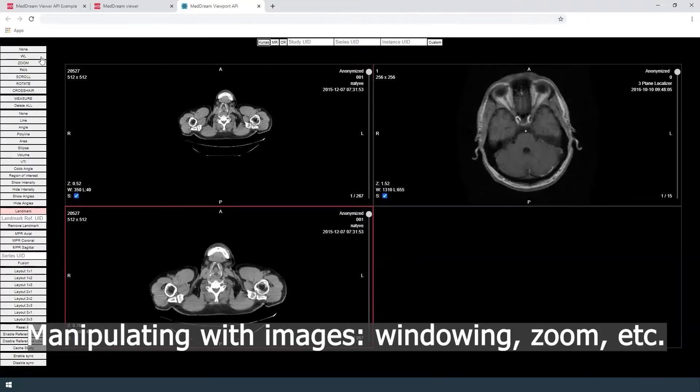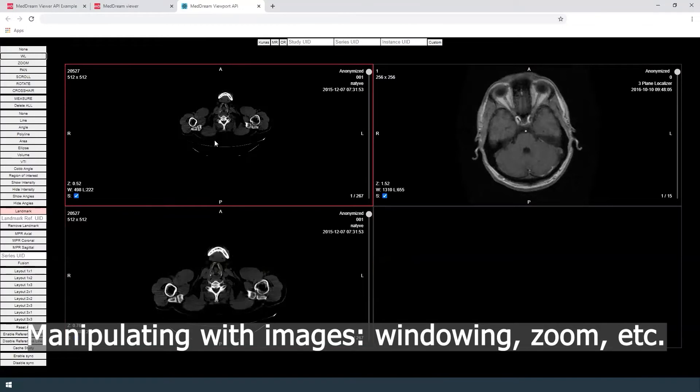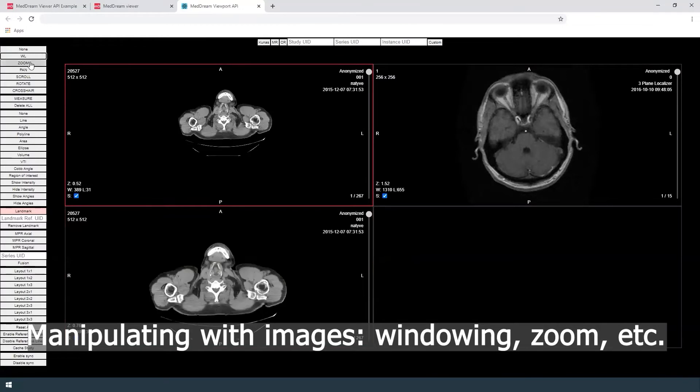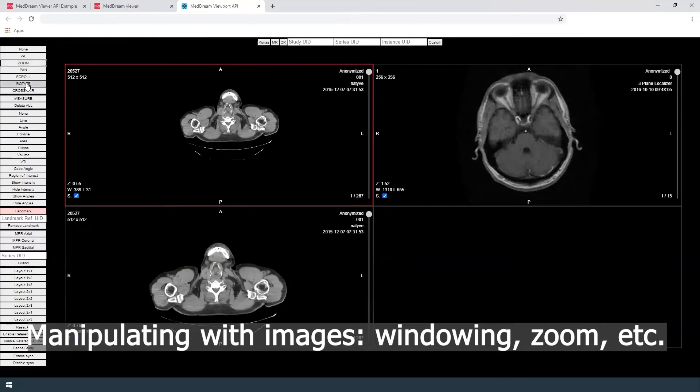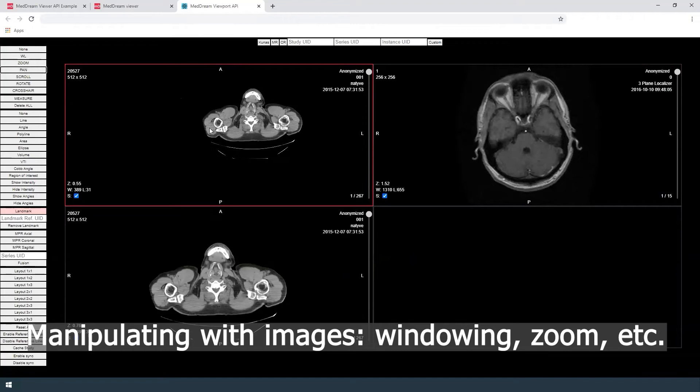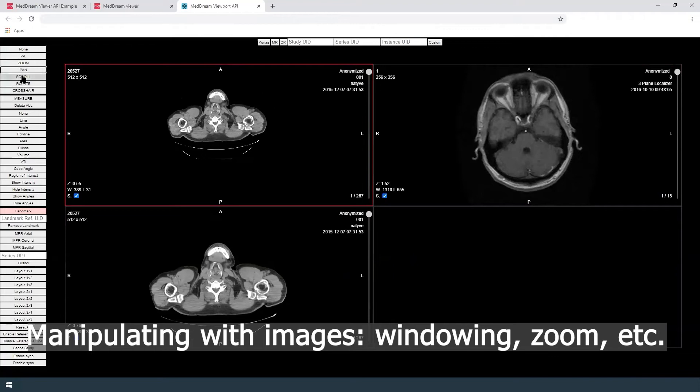The user can manipulate images, for example change windowing, zoom, pan, scroll, rotate, etc.